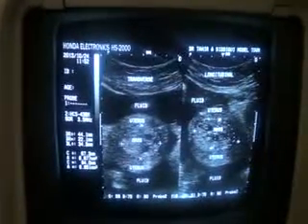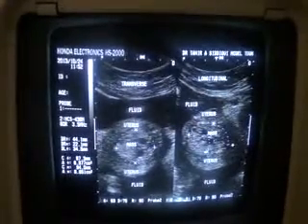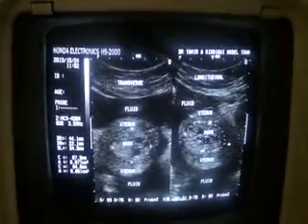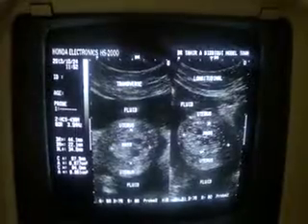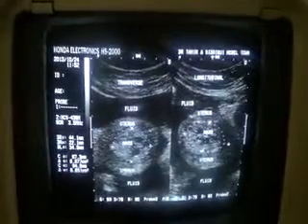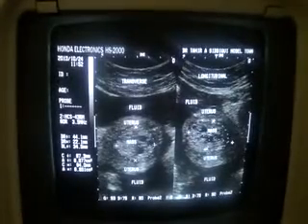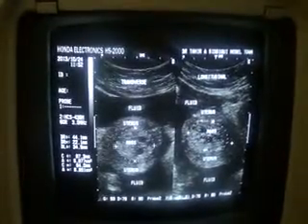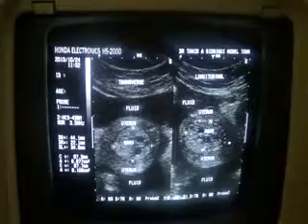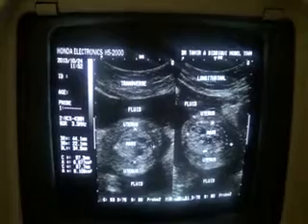This is an ultrasound study of a 55-year-old female with a history of sudden pain in the abdomen with swelling and protuberant abdomen, who has been referred for ultrasound to rule out any abdominal pathology. But while scanning, what I am seeing is a postmenopausal uterus in a patient aged 55 years.